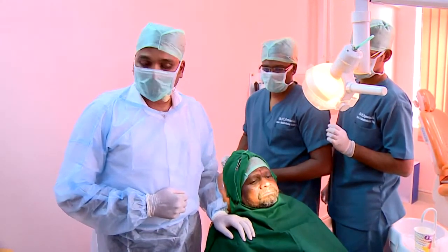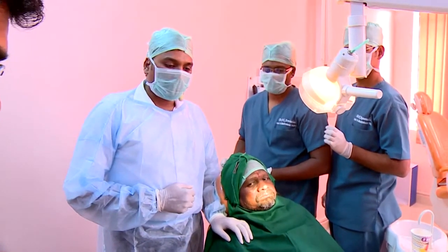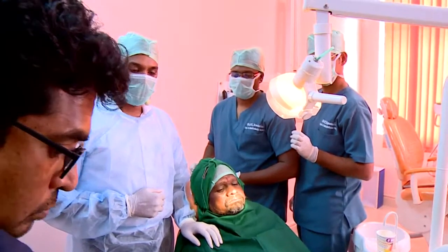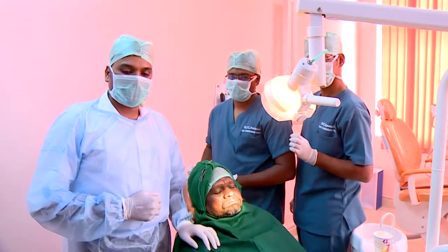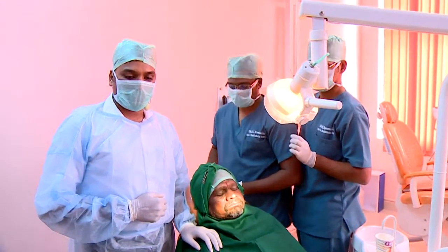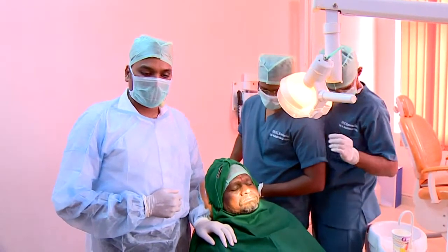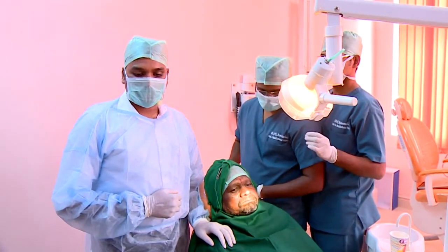What about the anesthesia? How much LA do you plan to give for the patient? We are planning to give 2 ml of local anesthesia, lignocaine with 1:80,000 adrenaline. The LA will be given as infiltration with a margin of 1 centimeter around the area of biopsy. As well, we are going to give a long buccal nerve block and a posterior superior alveolar nerve block for the buccal mucosa and the posterior region.